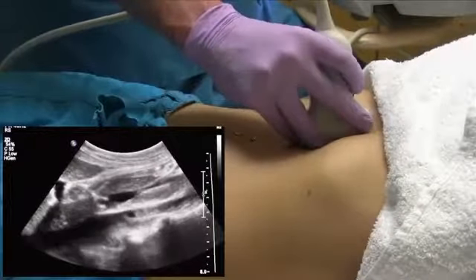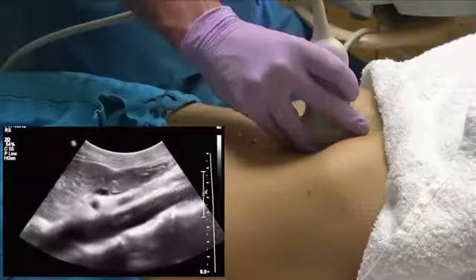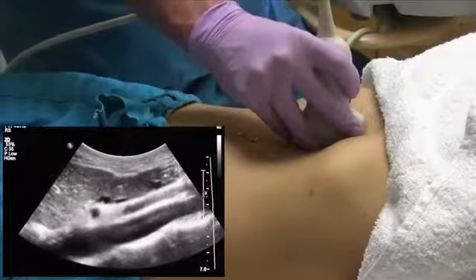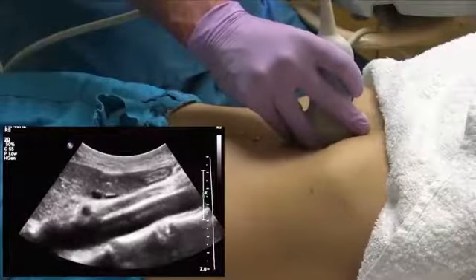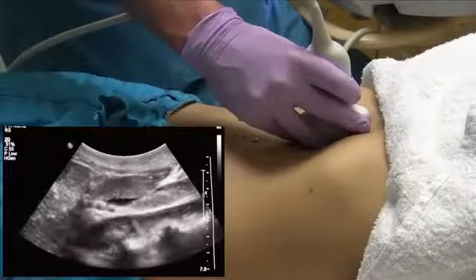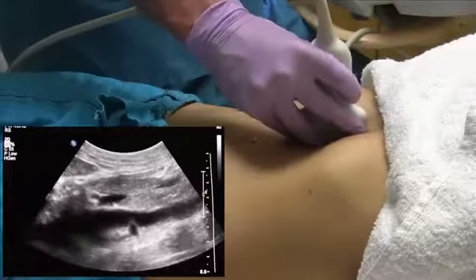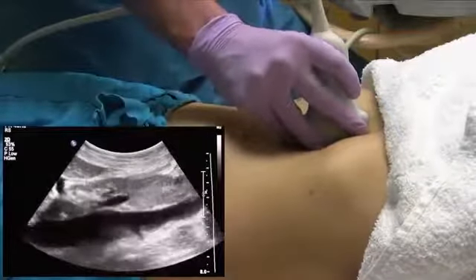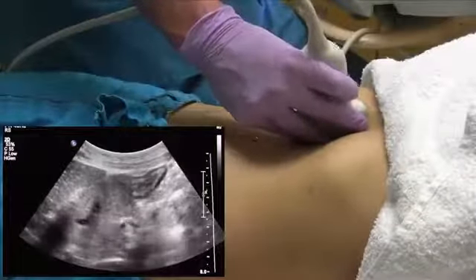As you sweep through the pancreas in a sagittal plane, you can use other structures as your landmarks to know where exactly you are within the pancreas. So a good rule of thumb is if you're seeing the aorta posterior to the pancreas, you're in the pancreatic body. And as you sweep more towards the patient's right side, when you see the IVC, you know you're in the pancreatic head or around the pancreatic head part. And as you sweep through, you can just evaluate the pancreas in a transverse plane here.